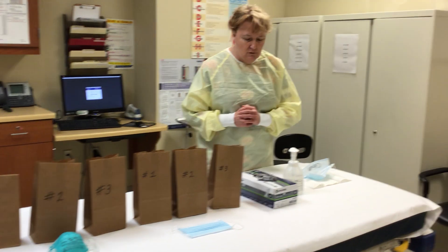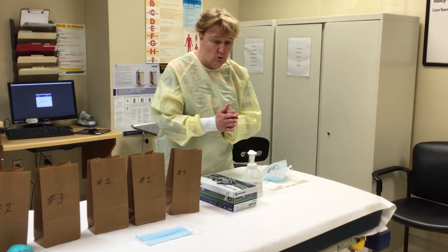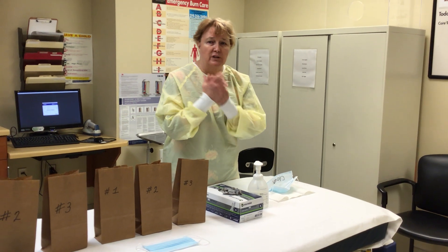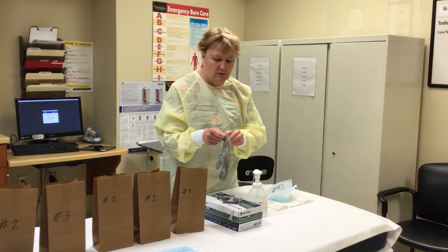For putting on masks, the most important thing you can do is hand sanitize or wash well. Make sure you put hand sanitizer on and rub your hands until they dry. You're going to want to put clean gloves on.